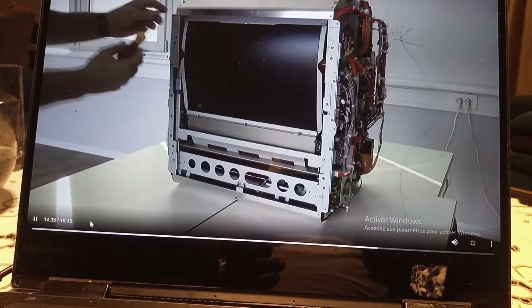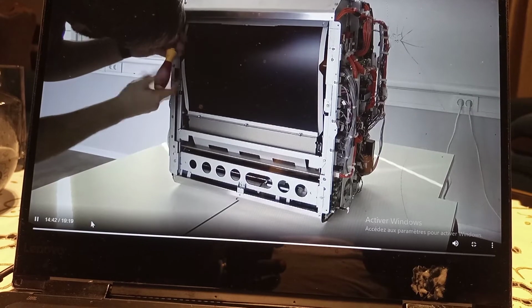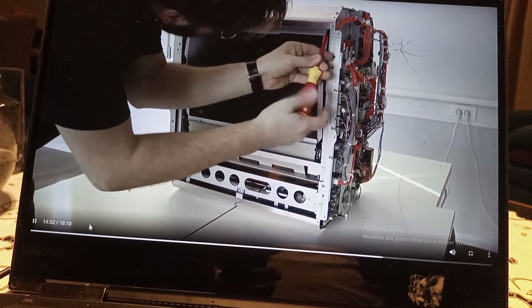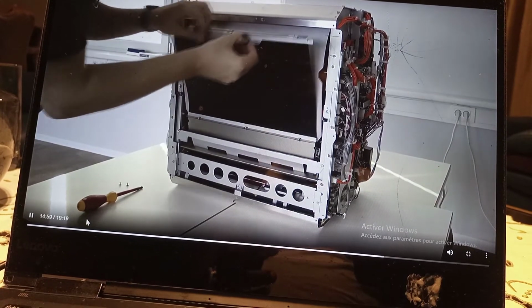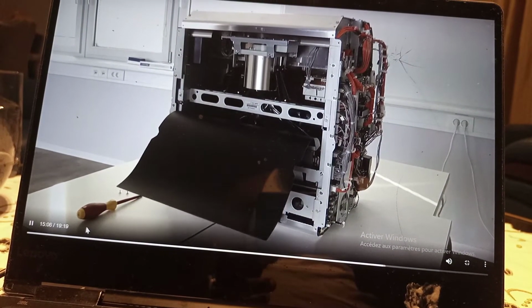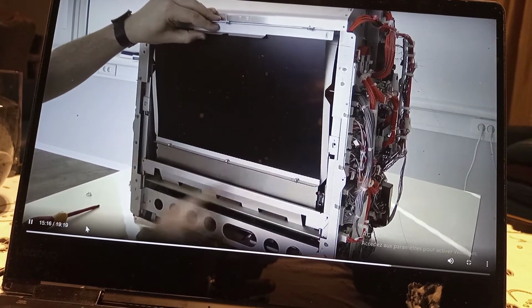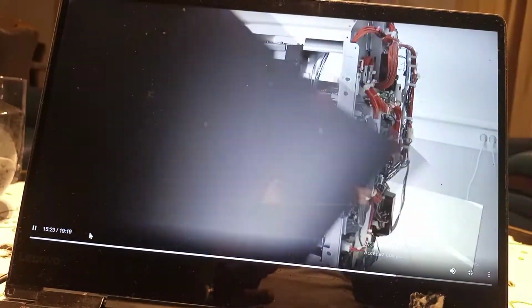And to have access to the inner parts, like the scanning unit or the light collecting unit, you have to remove 2 screws from this black plate here. And then you can open this, and have access to the inner parts. So the next step is to remove this part. So top is already loose. Just remove these 2 screws on the bottom, and you can remove it completely. It's like this.